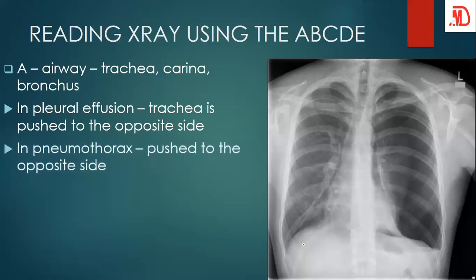And if you have pneumothorax, and I think this particular X-ray is for pneumothorax. Look at it. See the lungs here. You see the exposure here and here looks the same, up to this line. You can see some demarcation over here, and all of it looks the same. But this part looks a little bit darker, right? That could be an indication that there is a pneumothorax on the left. Don't forget, I said the right side of your image is the left side of the patient. So there could be a pneumothorax on the left.